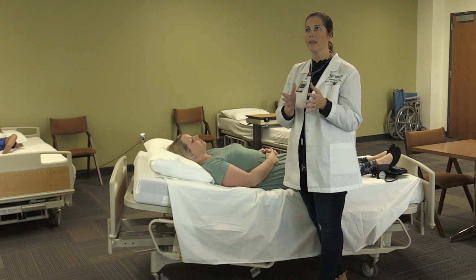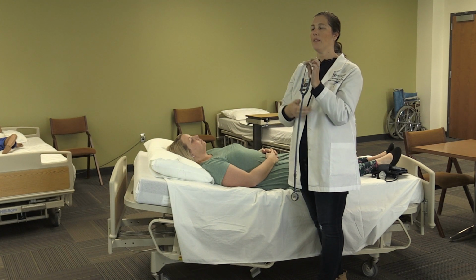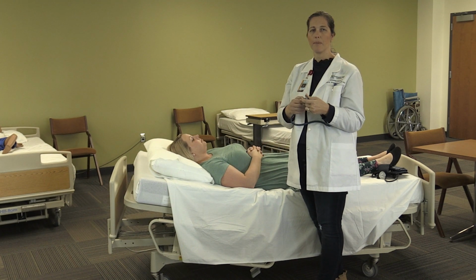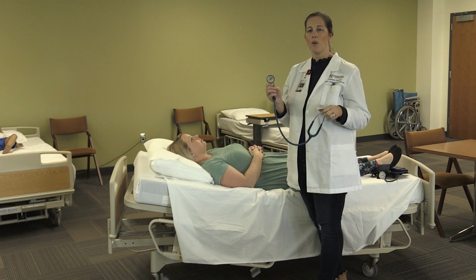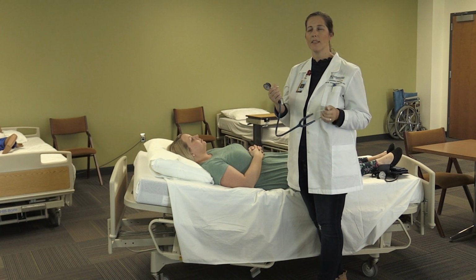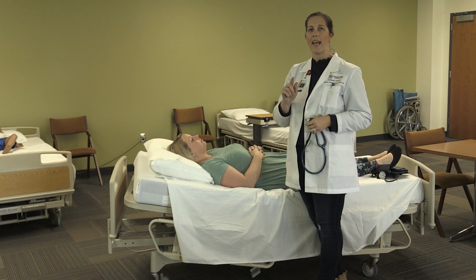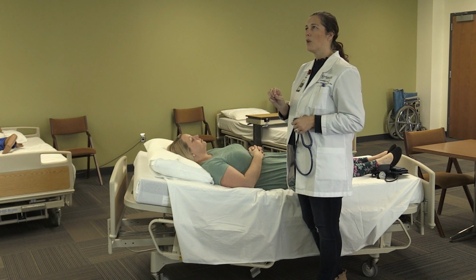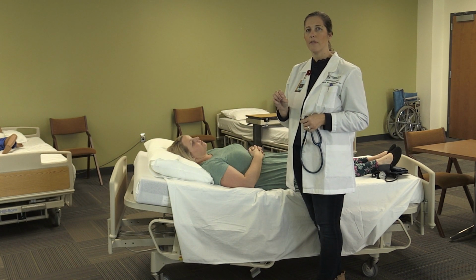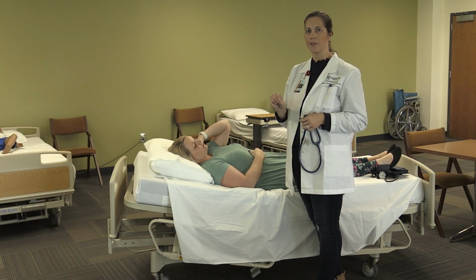I also want to make sure that I am using the diaphragm of my stethoscope, which is the larger part right here. So when I'm listening for that, I'm listening for that lub-dub sound. That is the S1, S2 heart sounds. So the closing of the valves creates that S1, S2 sound.